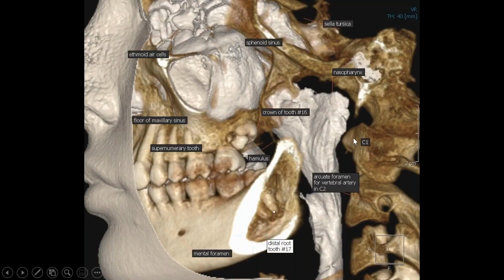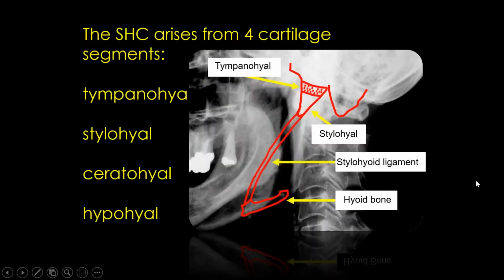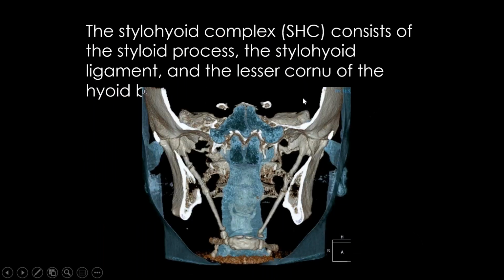You can look at them in 3D color. We saw this earlier without any of the markings on it, but you can make a 3D image to look at it. One of the important things to remember is that it's very uncommon to have Eagle's syndrome. It is a syndrome. It's not just the calcifications that you see of the styloid process. Syndromes also go along with signs and symptoms. So if they have a fishbone feeling or pain on swallowing that's neuralgic in nature and they have an elongated calcified process, they could have Eagle's.